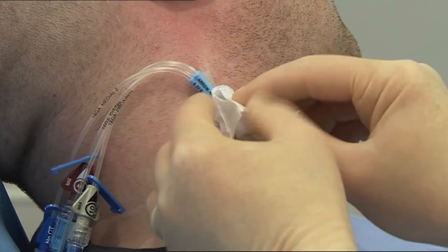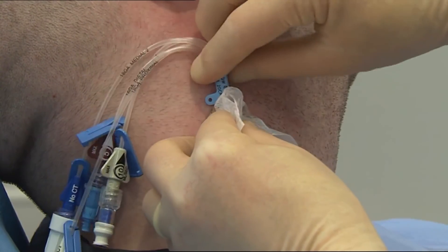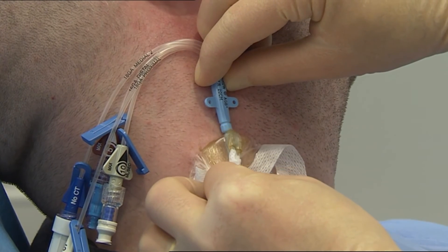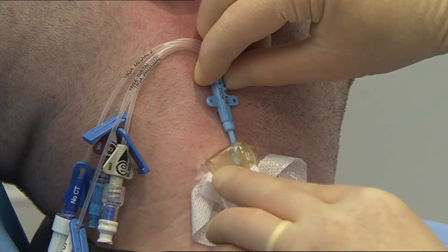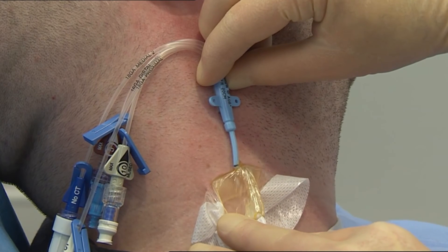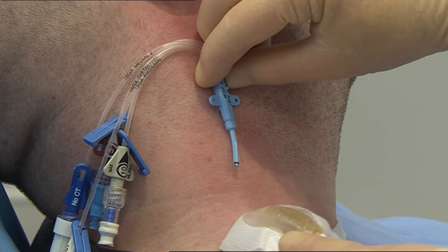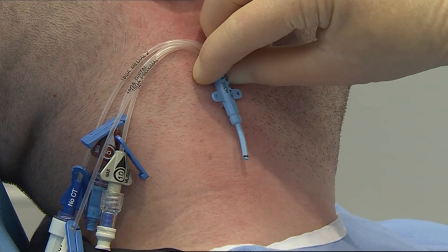Finally, peel the dressing towards the catheter insertion site, supporting the skin and catheter to minimise the risk of catheter dislodgement. A medical adhesive solvent or a drop of sterile solution may be used to facilitate removal, but this is not always necessary.